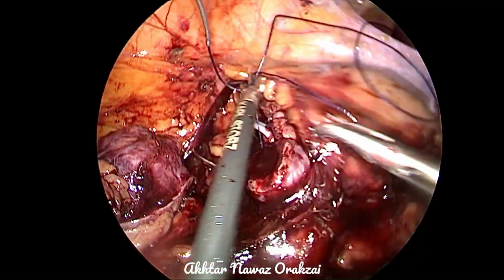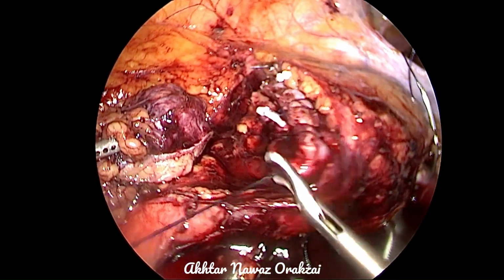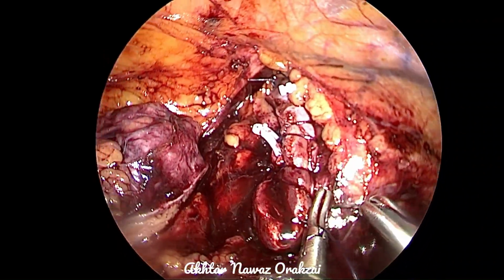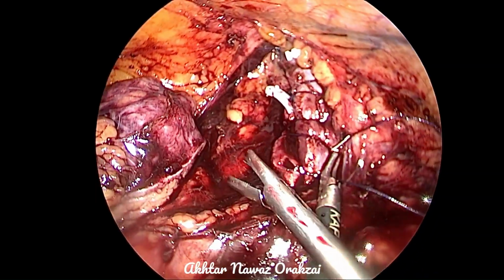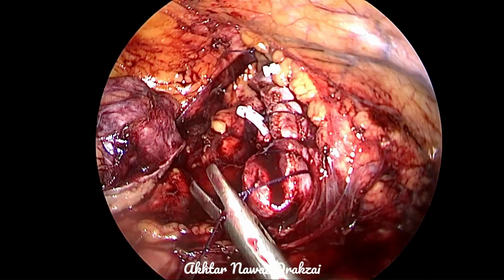However, I have been given a sample. It was too generous of Ethicon. They have provided me a sample of the Stratafix, but that suture was 2-0, and its length was 30 centimeters.